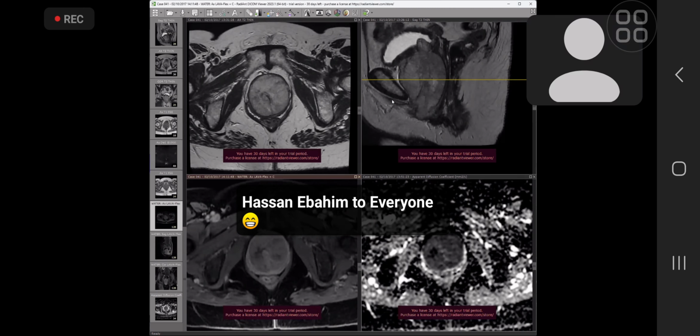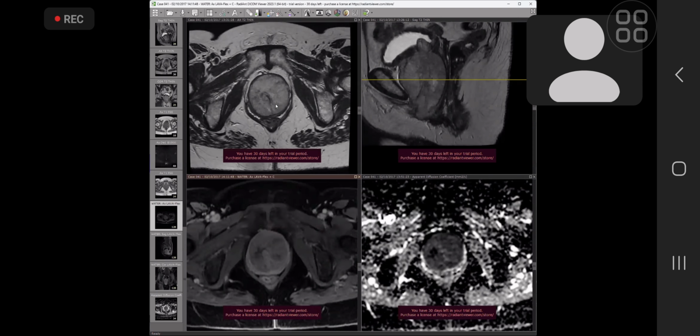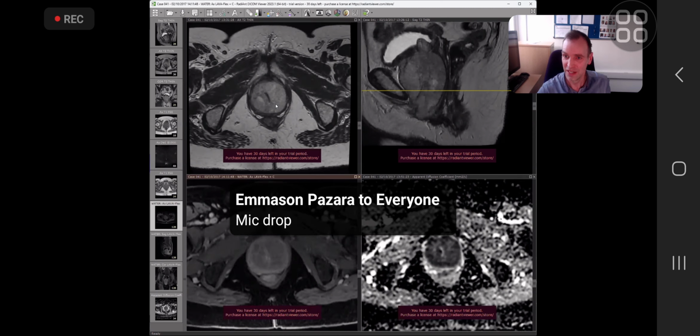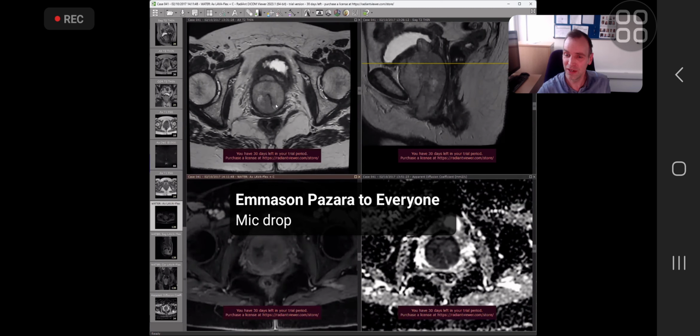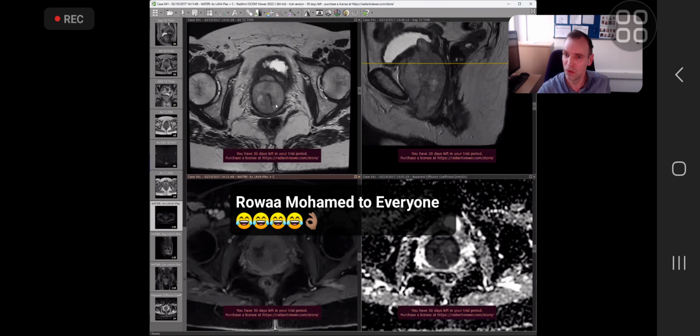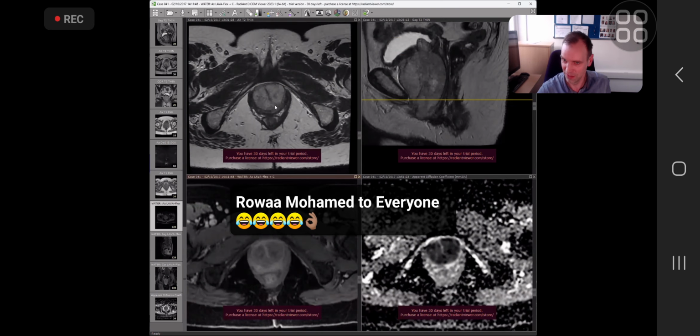No, I didn't see that. I know. And you're going to know that if you're on a reporting list, it's a female patient and it's a gynae protocol pelvis, and you've been given a history. I deliberately withheld the history. But do at times be careful. The examiners do like to play tricks. So you do have to keep your wits about you for different things.